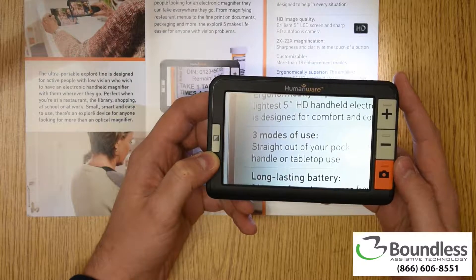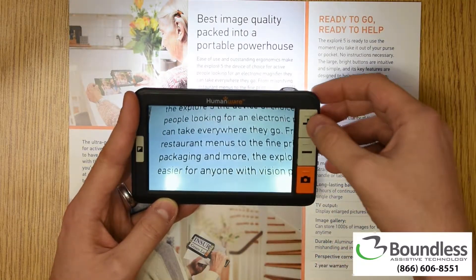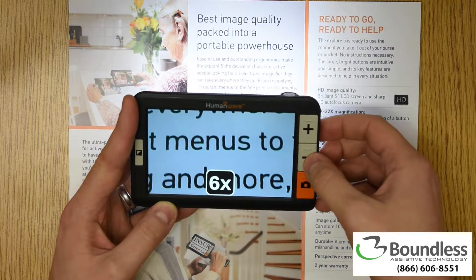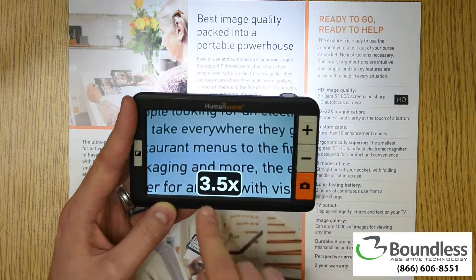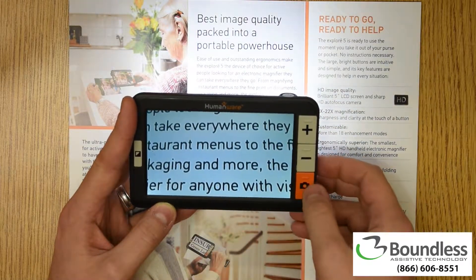Let's take a closer look. On the right-hand side of the device, we have three buttons. The one closest to the top increases the magnification. The one below that reduces the magnification. Every time you make an adjustment, it shows you what magnification level you're on.